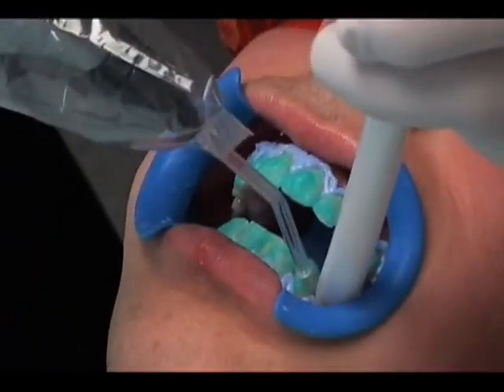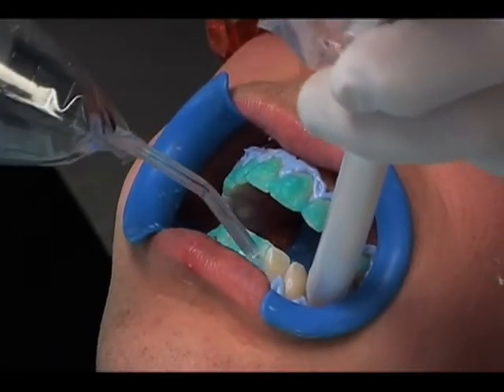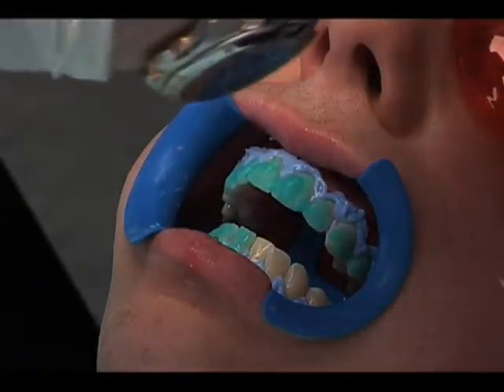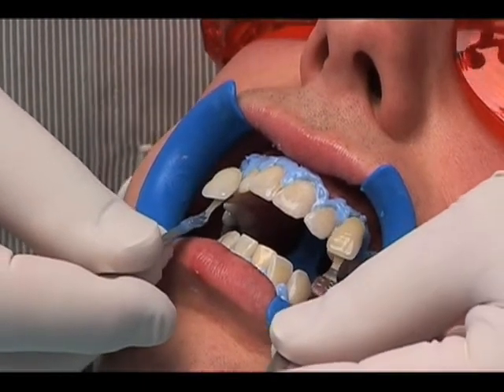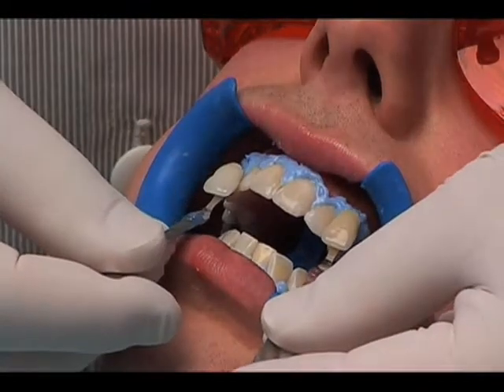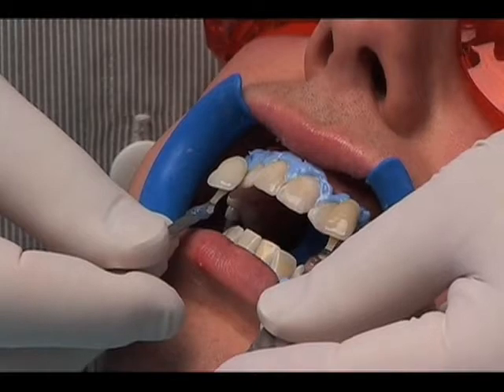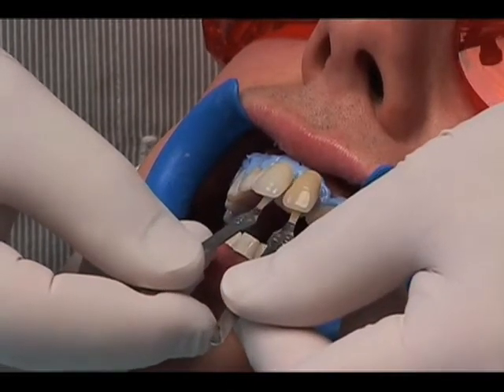After the last application, suction off the remaining gel and use your air water syringe to rinse the teeth. Use your high-speed evacuator to suction as you are rinsing. Make sure the whitening material does not enter the oral cavity. Together with the patient, record the post-operative shade and compare it to the pre-operative shade. After only two applications, the teeth of this patient lighten from A3 to B1 shade.